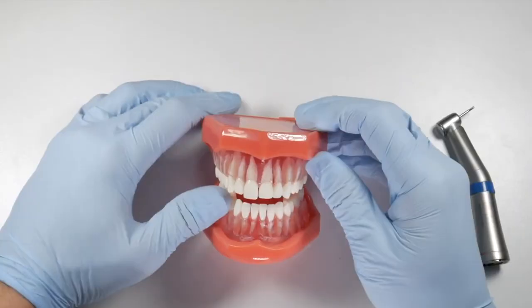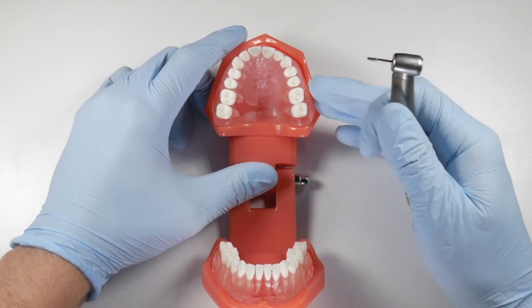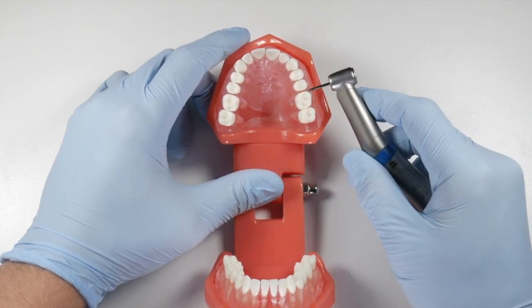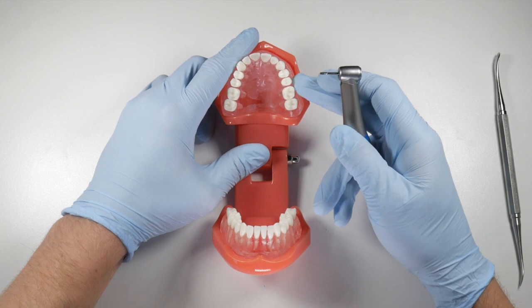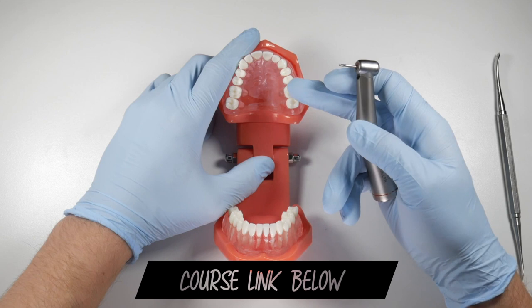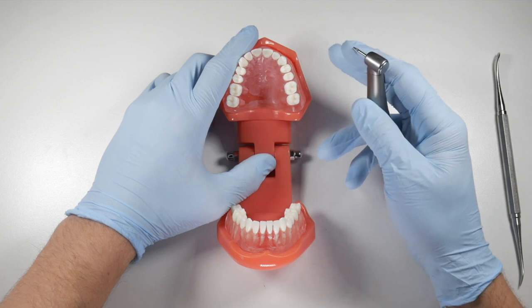When you're sectioning teeth — say you're doing an upper molar — you're going to section this tooth. Typically you're going to cut that Y-shape pattern into there, which is going to leave you with three pieces of tooth, which is terrific assuming you have three individual roots. What I will typically do is start by sectioning off the crown above the height of contour. That's going to open everything up into the pulp chamber so you can see the root structure. You may see a C-shaped root canal, which would indicate fusion of two roots — not three separate roots like you thought when you first looked at the PA.